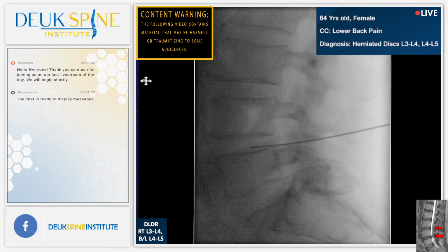So we're in at 4-5 on the right. Now we're going to do 3-4. The first step of this surgery is to put in some needles. We're going to make a 7mm cut. The whole surgery is done through this one little cut, 7mm. It's a relatively bloodless surgery.